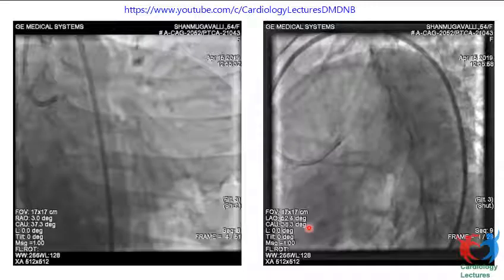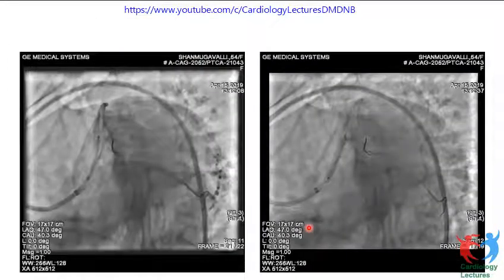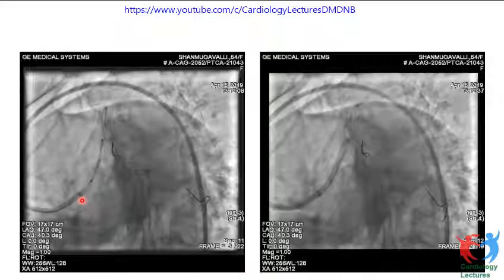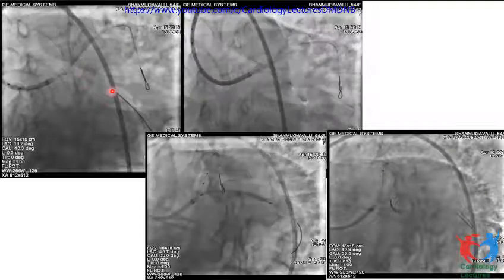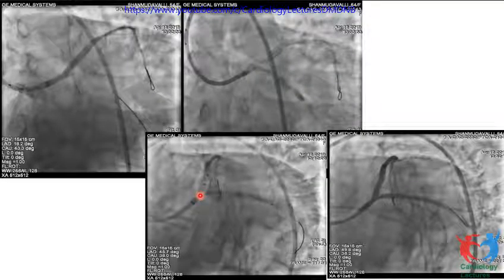Another case here, left main bifurcation, where you see that there was a stent deployed from LAD to left main to LAD, crossover in that circumflex lesion. Once that was done, the circumflex got occluded and the patient became unstable. So probably there was a dissection somewhere here that extended here. We don't know what was happening. We had to rewire the LAD, LCX very quickly. And then I put probably a TAP or a T stent. This was done under emergency. We couldn't do any imaging because the patient was sick.